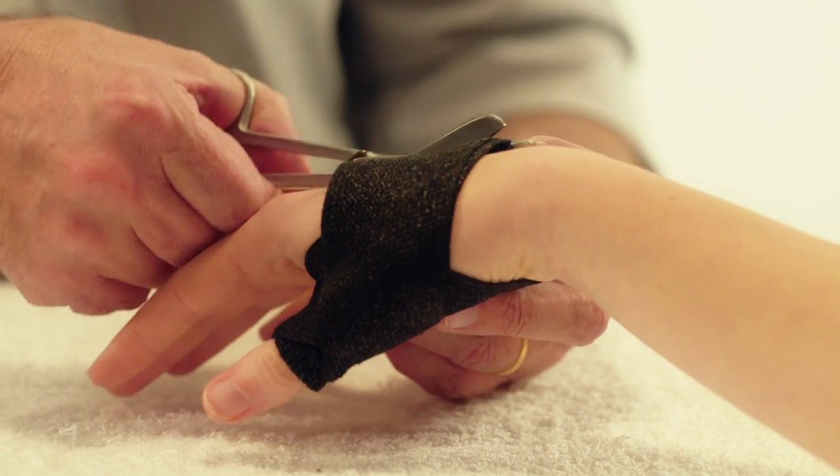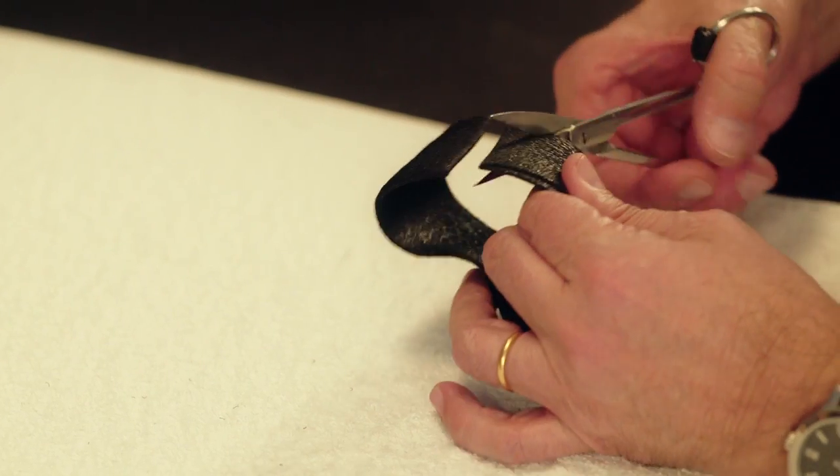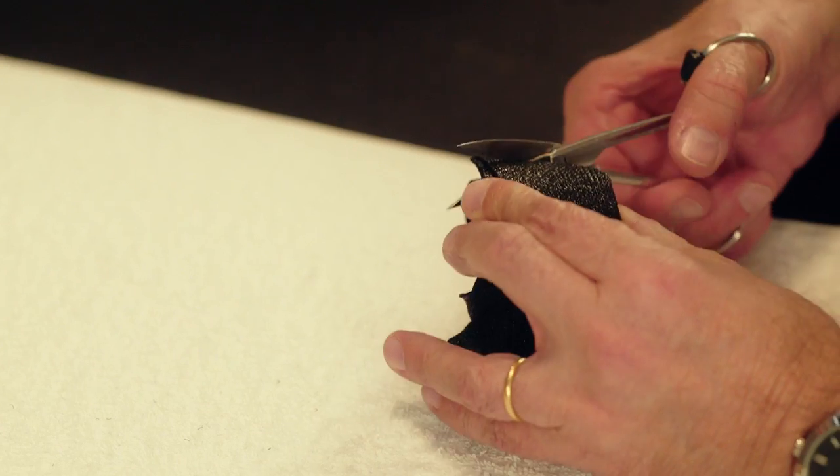When the orthosis has hardened, cut the dorsal band with bandage scissors and round the corners of the two cut edges.